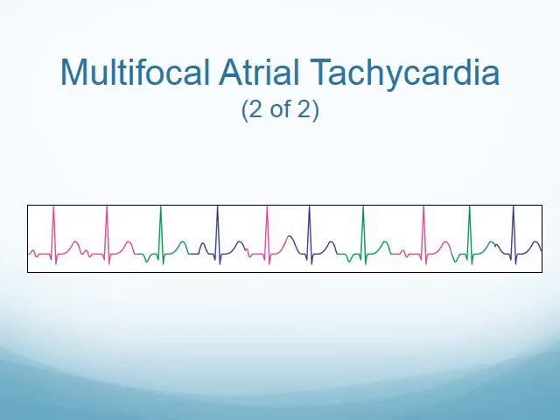Here's an example of a multifocal atrial tachycardia. You'll notice that it looks remarkably similar to a wandering atrial pacemaker. The biggest difference is going to be the rate. So we have our 3 different atrial foci that are causing our pacemaker beats.